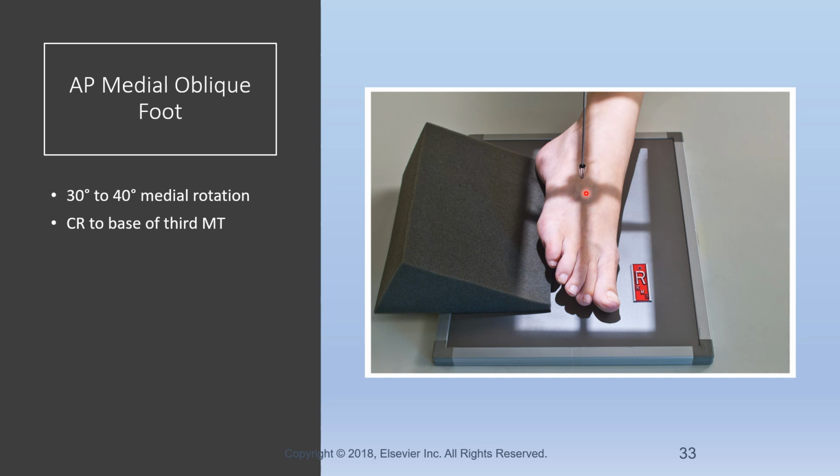Okay. I typically tell you that visualizing that sometimes is hard, but what you can usually palpate is the tuberosity at the base of the fifth metatarsal. And when you do that, especially on this, it puts that tuberosity in profile. I'll show you on the next image. But if you can palpate that fifth metatarsal tuberosity, the way the bones of the foot go is typically, it's easier for me to draw this.